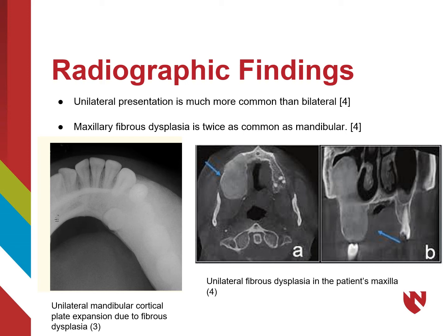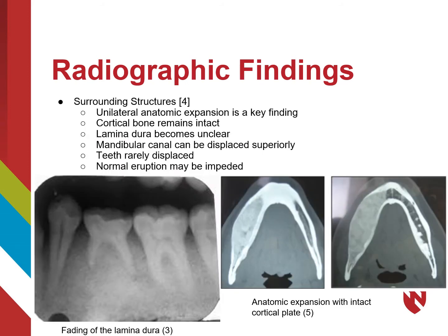On the picture on the left, we see a mandibular occlusal radiograph with unilateral fibrous dysplasia that has expanded the buccal and lingual plates. On the radiographs on the right, we see an axial and coronal view of the patient's maxilla with unilateral fibrous dysplasia on the patient's right side. Unilateral anatomic expansion is a distinct finding with fibrous dysplasia. This means that the overall shape and form of the bony structures are maintained and intact, but they are expanded.